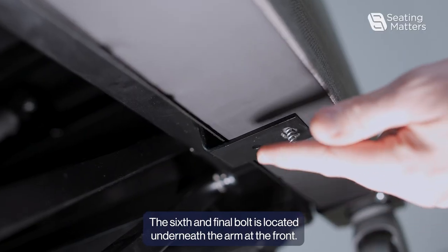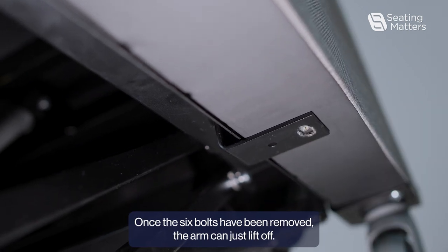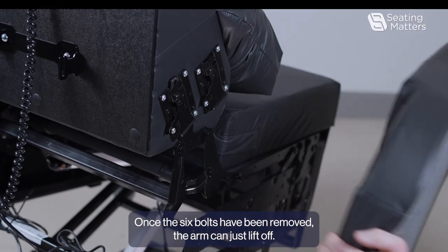The sixth and final bolt is located underneath the arm at the front. Once the six bolts have been removed, the arm can just lift off.